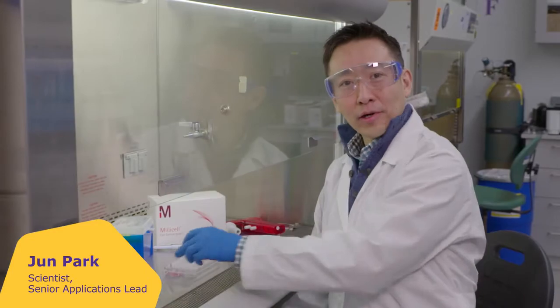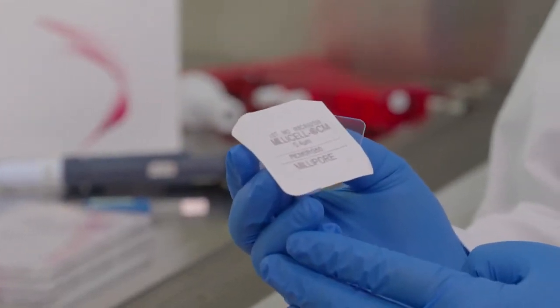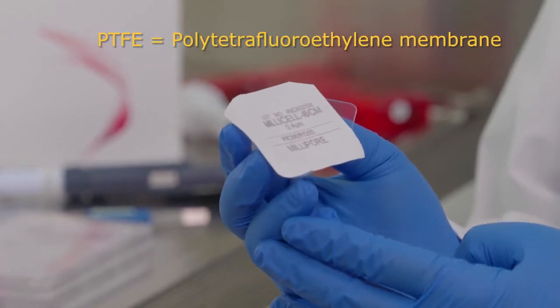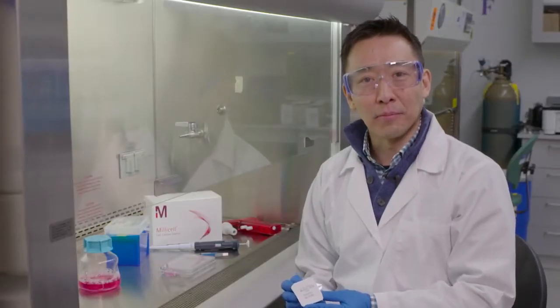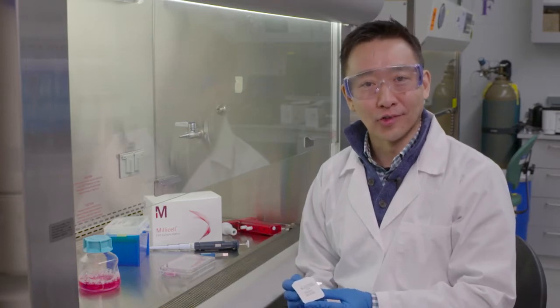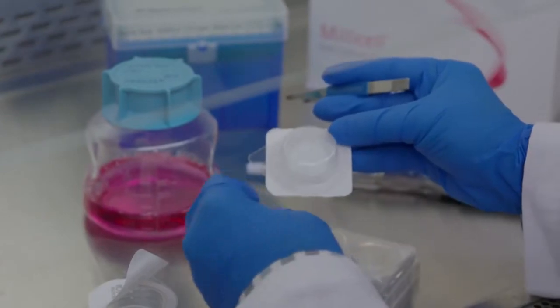Today we'd like to go over some tips and tricks in how to use our Millicell CM inserts. These have a PTFE membrane, so there are certain tips and tricks that will be very helpful for you in terms of preparing these inserts for your assay. This is how the insert is packaged and what it looks like.